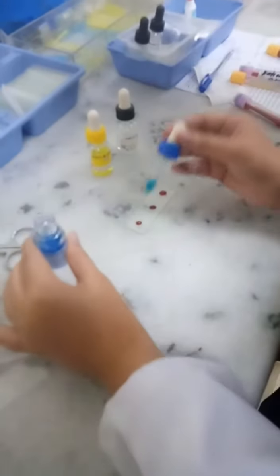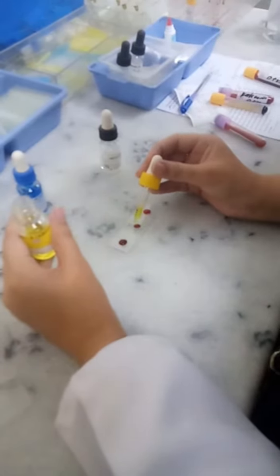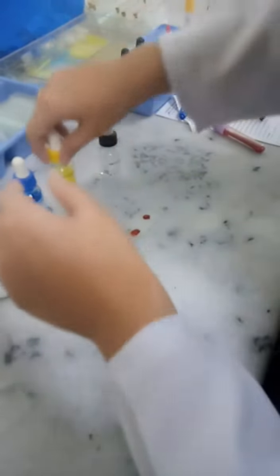We are going to add one drop of anti-sera A. Remember that the tip of the antisera should not touch the blood. Now anti-sera B — we will add one drop of it. And now anti-sera D, which is transparent, we will add one drop of it as well.